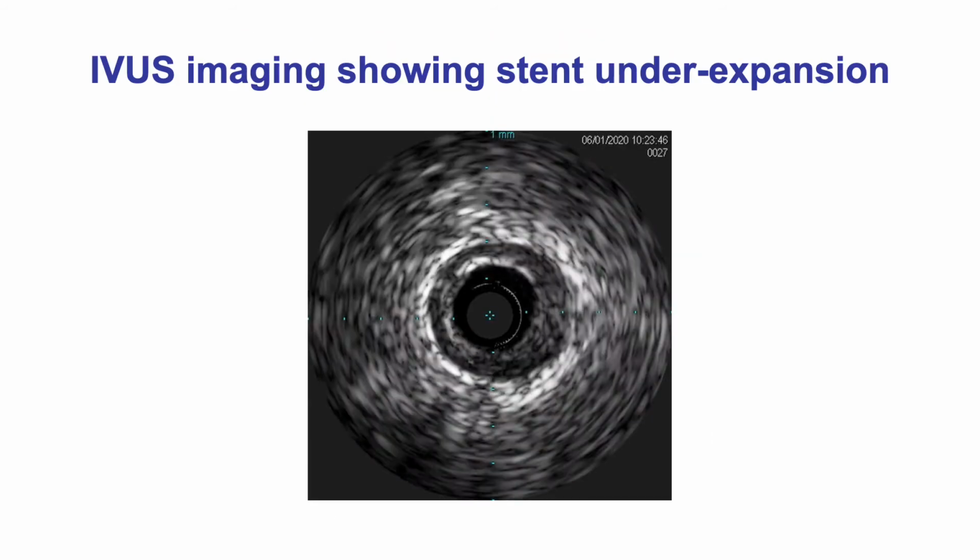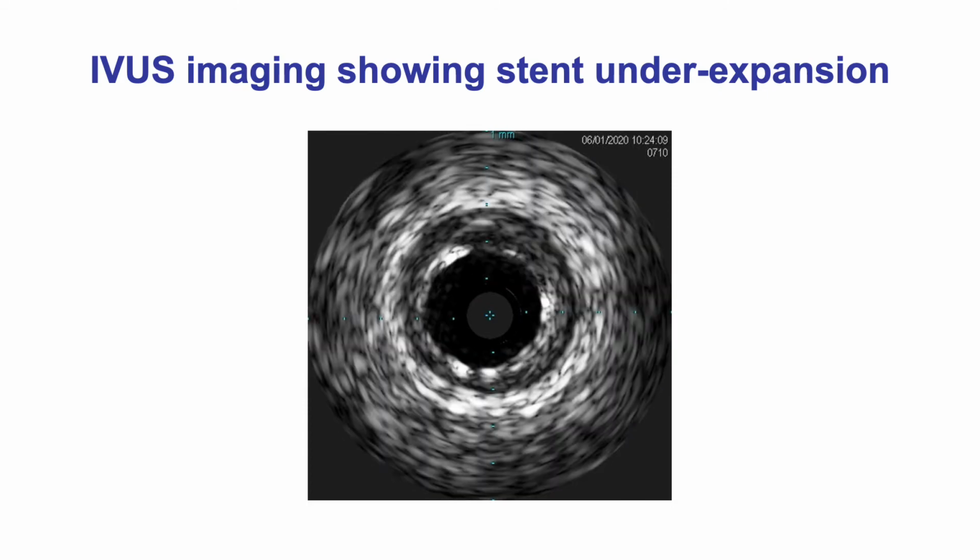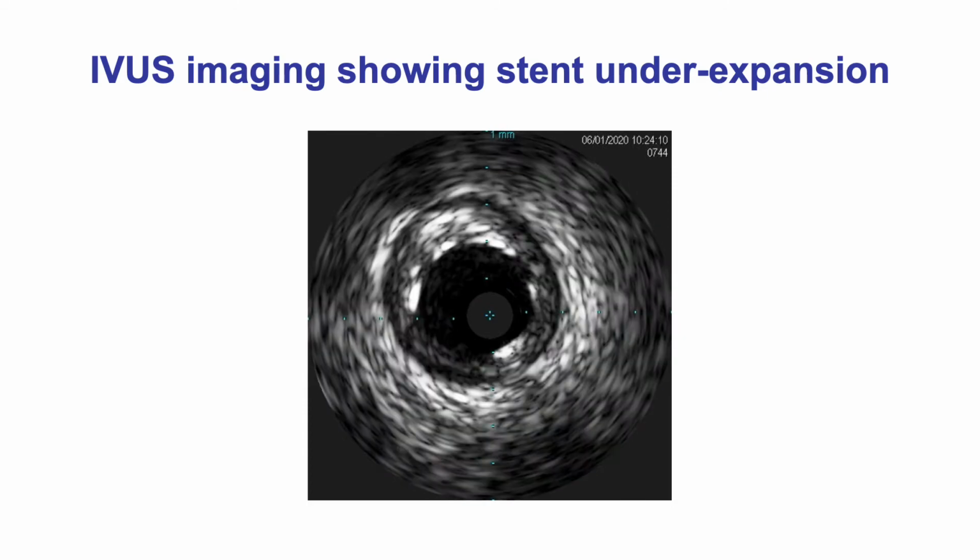So in this case, actually, IVUS showed the stent under expansion, as you can see here, with some degree of malopposition.